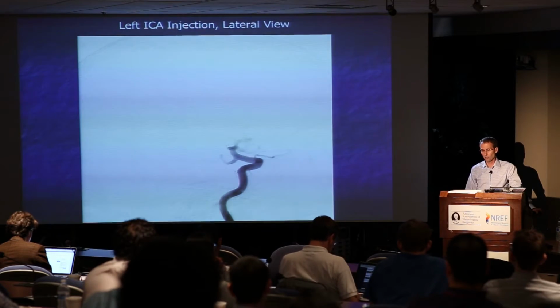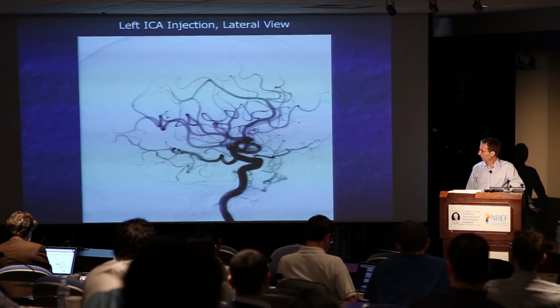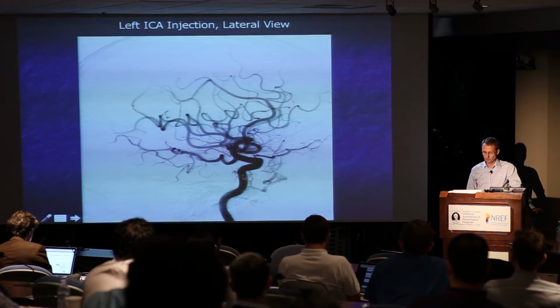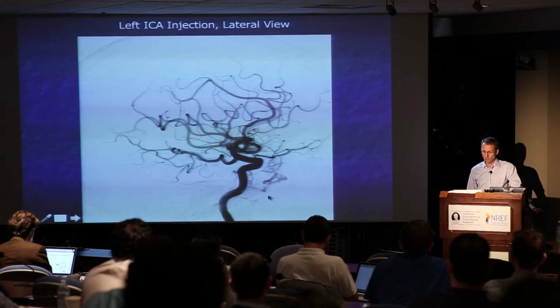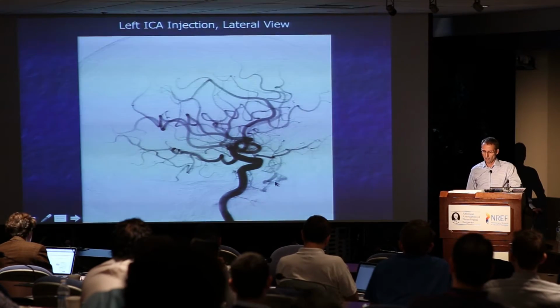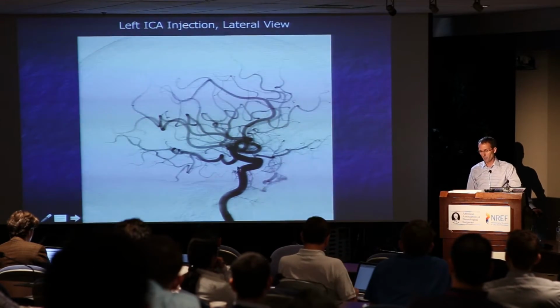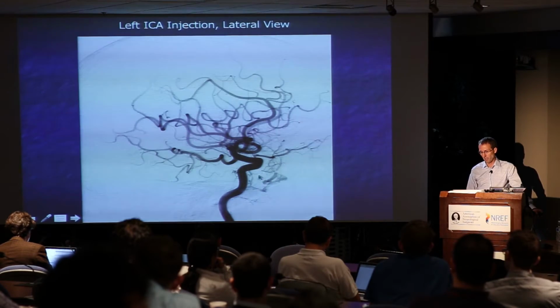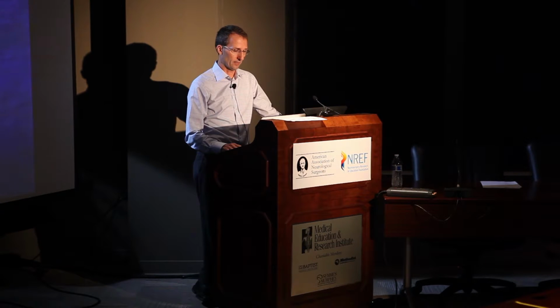We do an internal carotid artery injection, looking at the other venous outflow. One thing you'll notice is that this is probably the inferolateral trunk coming off the cavernous carotid, coming down, and it's also contributing. You actually don't see the high-risk cortical venous drainage because of the competitive inflow to the fistula, but you know that that is where this is going. So we've identified an important branch coming off the cavernous carotid.